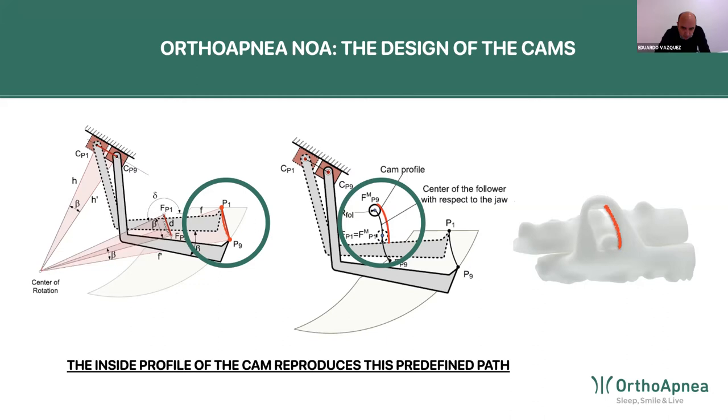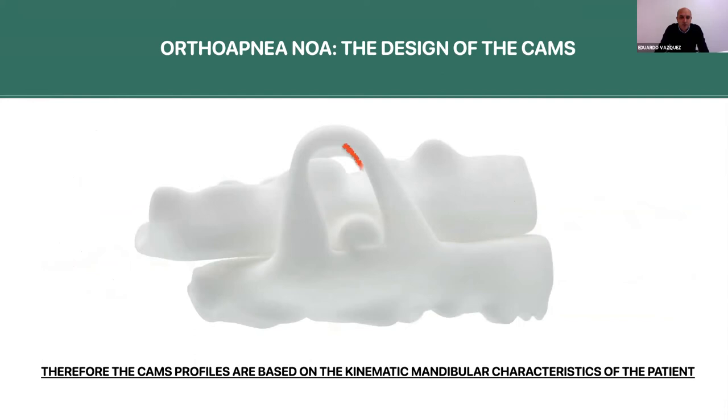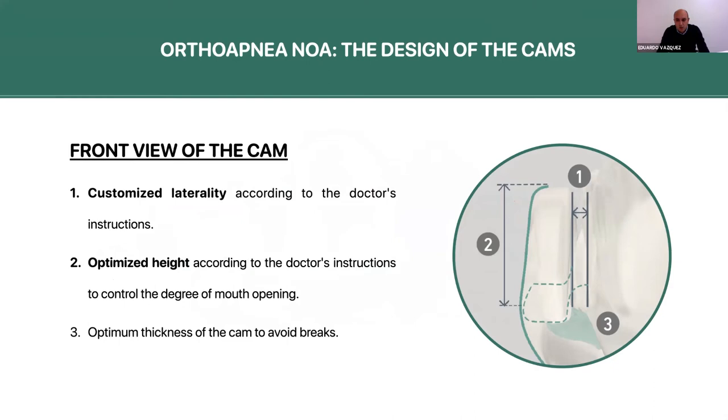So as I said, the inside profile of the cam is based on the mandibular kinematics of that particular patient. Here you can see a front view of the cam. Something also very interesting from the NOA is that you can also customize the degree of lateral movement. By default, the lab is going to allow between 2 to 3 millimeters of lateral movement.